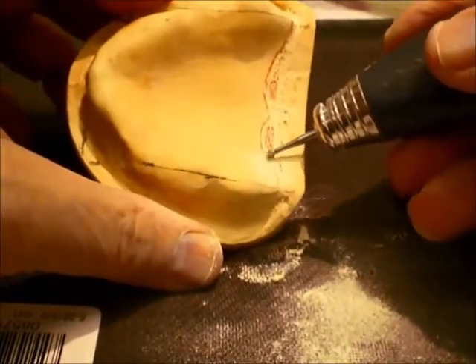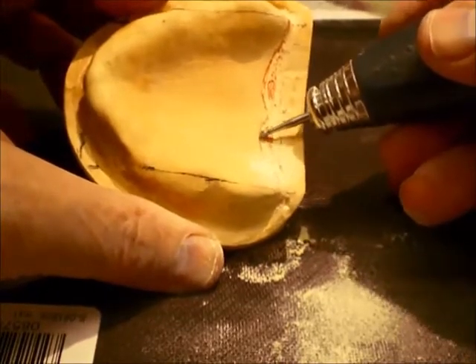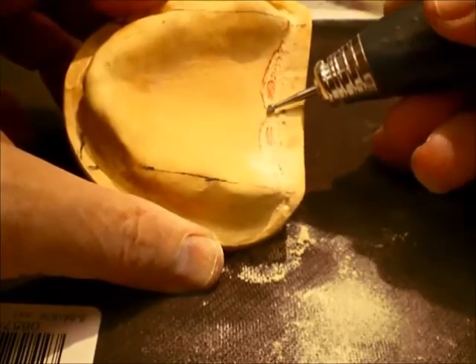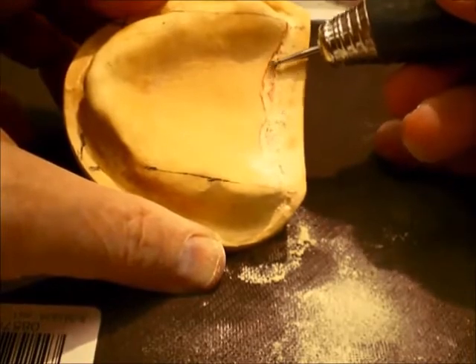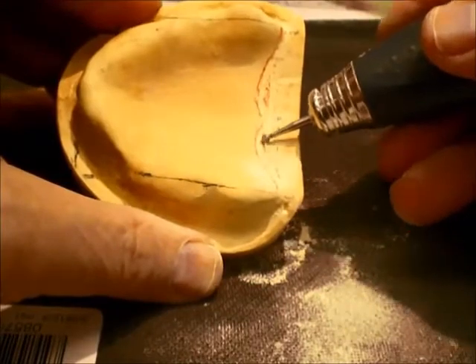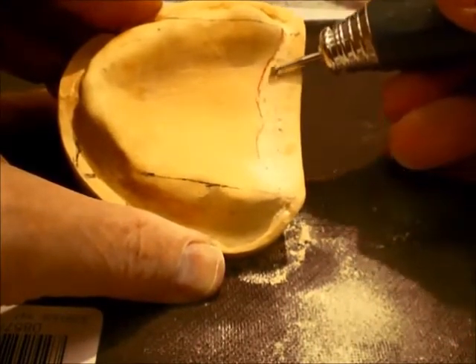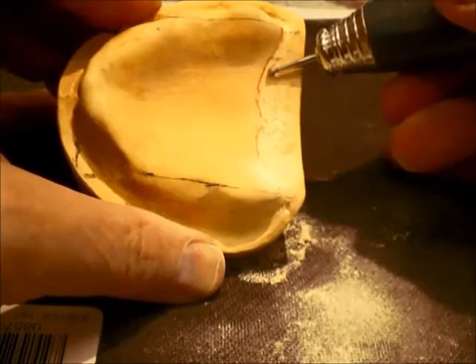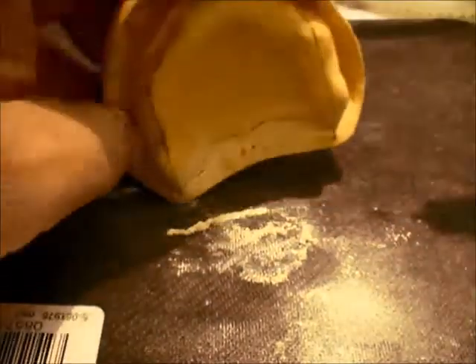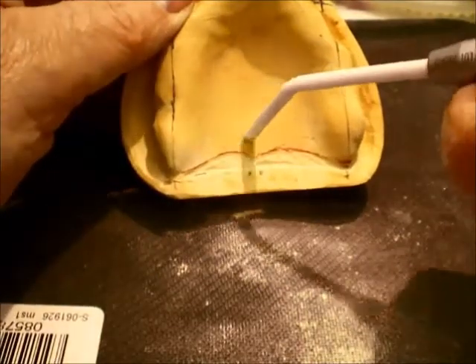Now the posterior palatal seal area will be tapered and feathered, outlining that and removing some stone. This stone will be represented in the denture after it is processed, so it needs to be as smooth and neat as you can get it.